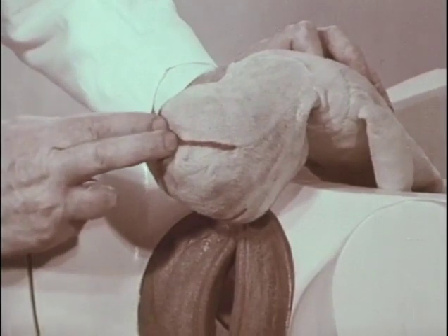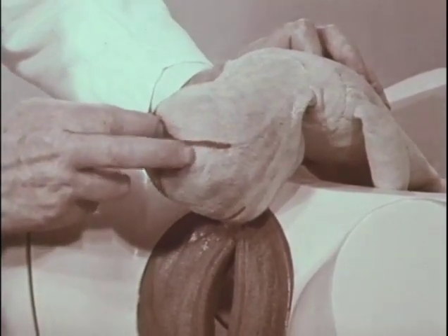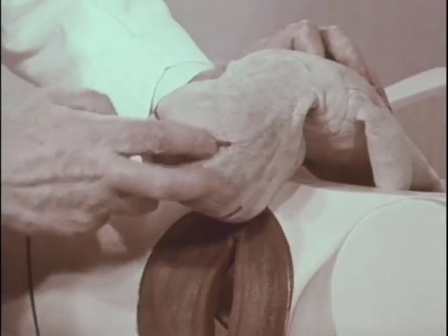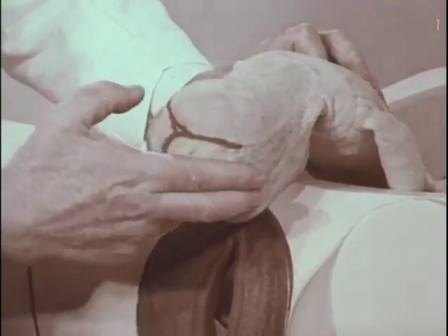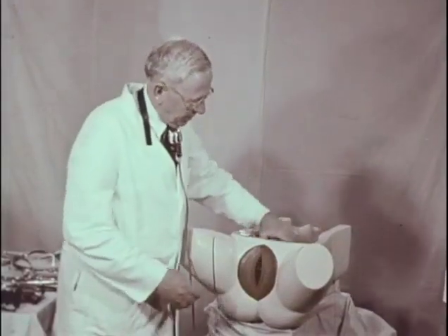Once the occiput is around to the anterior positions, the fingers creep around behind the posterior parietal bone to act as a splint to prevent backward rotation of the occiput. Now for the demonstration with the instrument.